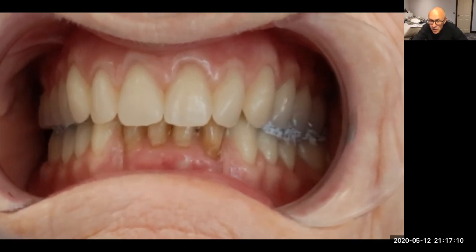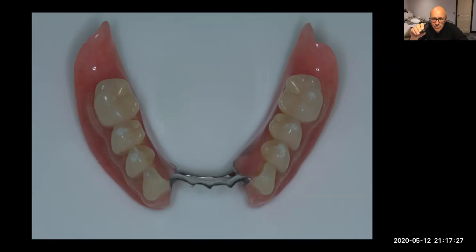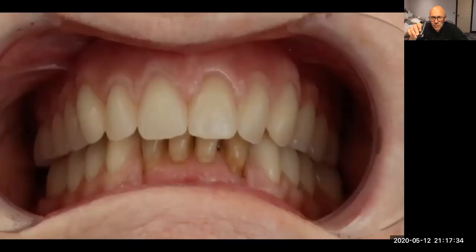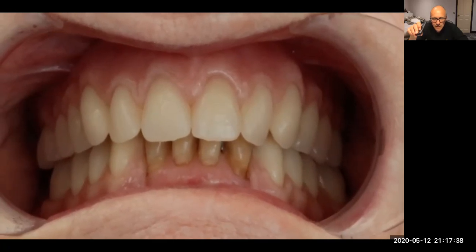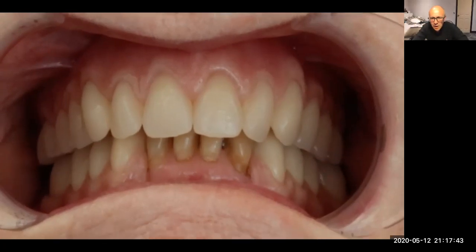I get them to work on the bit, sand that area down. So these are Miriam's dentures, and you can see that she's worn little bits away here by grinding them. And then these are the lower two. You can see there are little areas that she's worn down there, and just doing this made the occlusion, okay, tap together, tap. If you tap working, nice and firm, go for it.